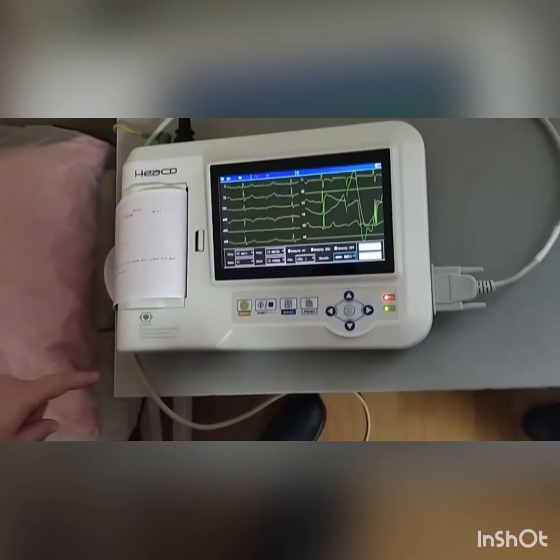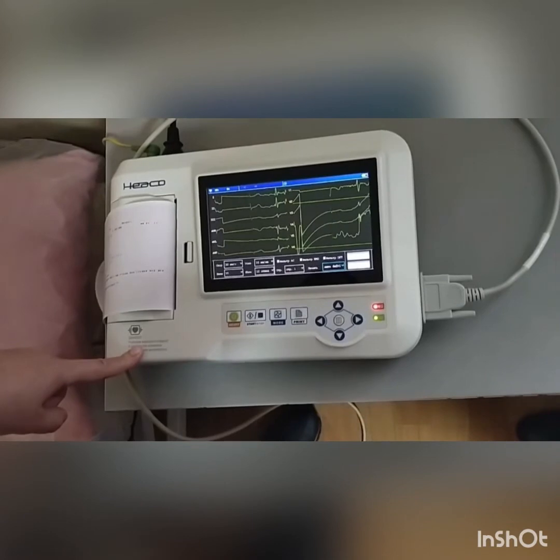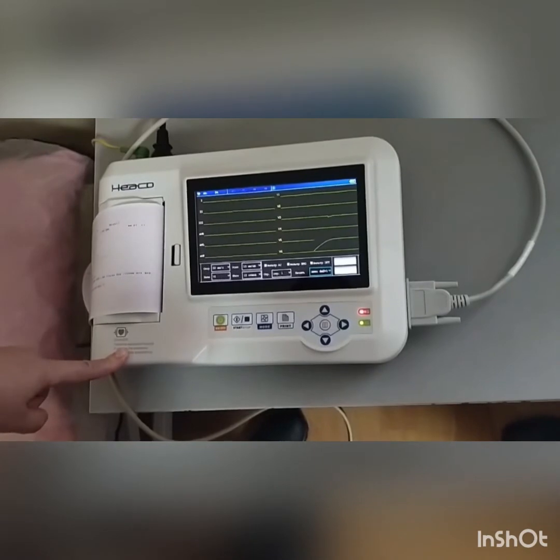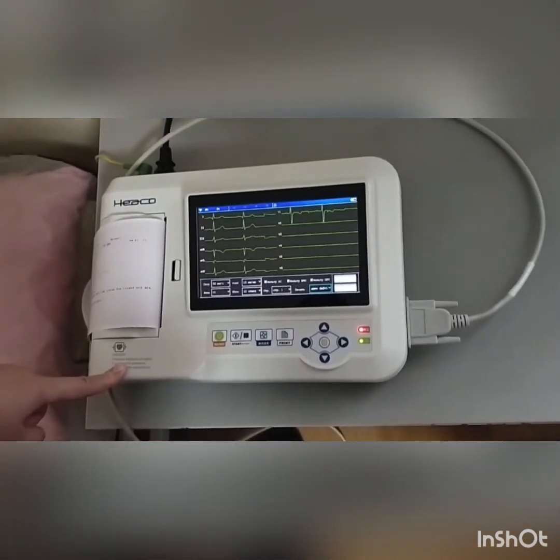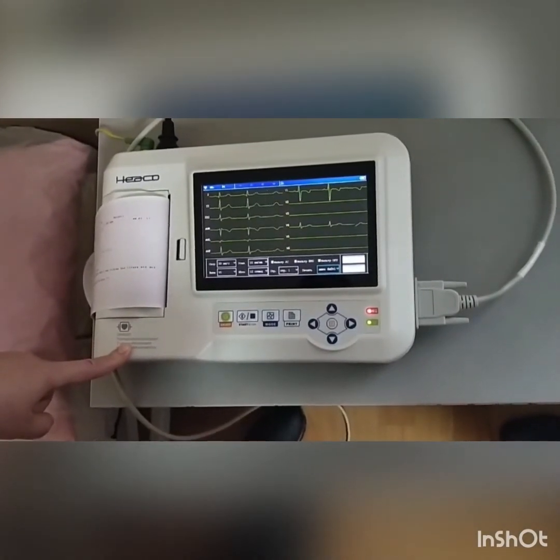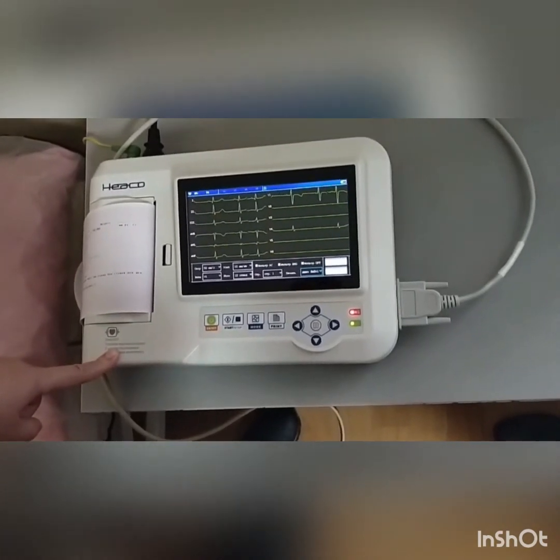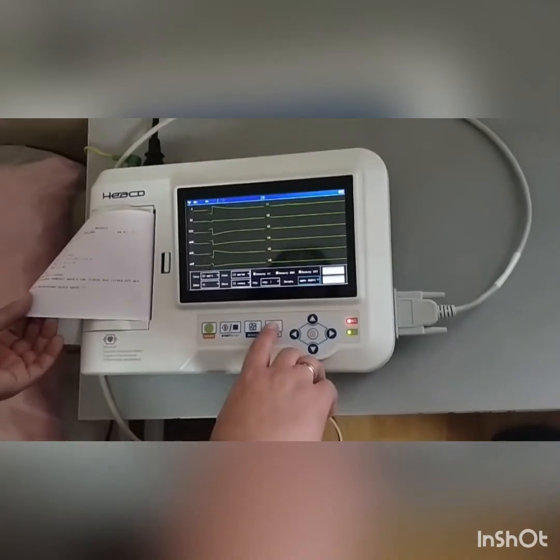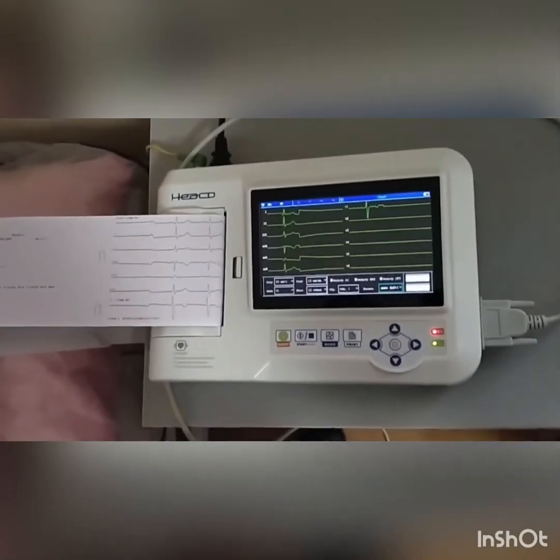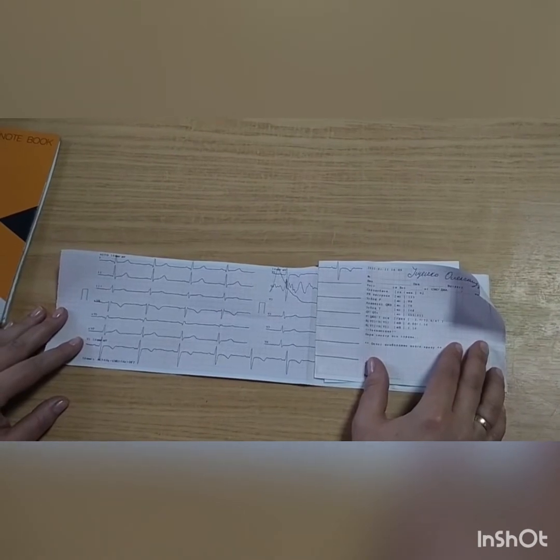We begin the registration of the electrocardiogram. To do this, we must set the speed and also enable filters. On this register, all this is already done automatically. Therefore, we can check the calibration of the apparatus. For this, at the beginning of the tape, we can see the control millivolt, which will be 10 mm high. We start recording. We got a 12-lead electrocardiogram.